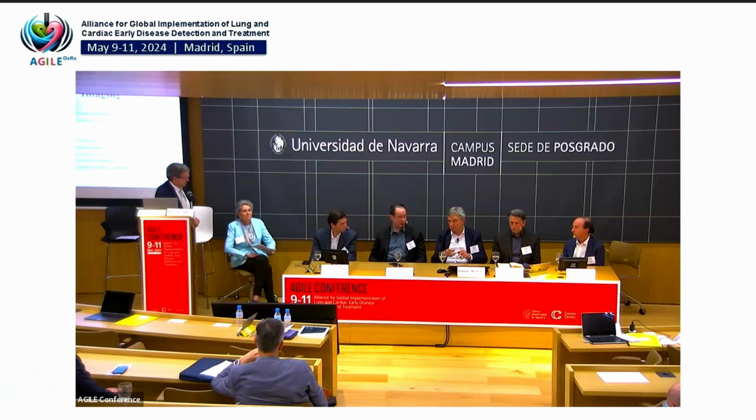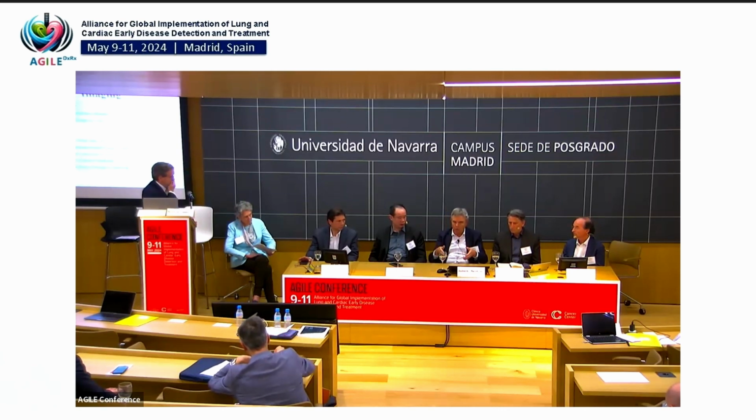But if you go down in the literature, then the threshold of minus 950 goes back even before the Hounsfield units. That comes from the era when we still had EMI units in 1982. There they even tried to make a kind of relationship with histology. And then they came to more or less a proposal that it should be somewhere around minus 950.